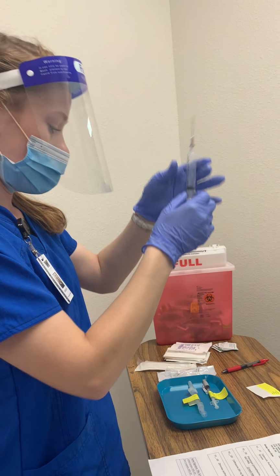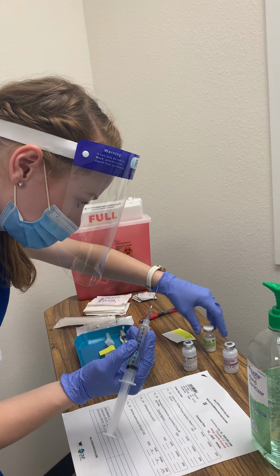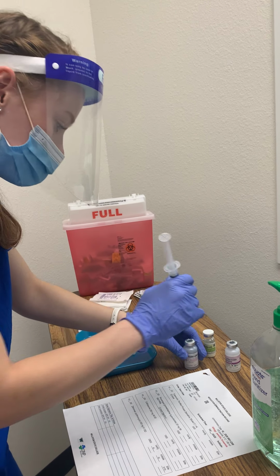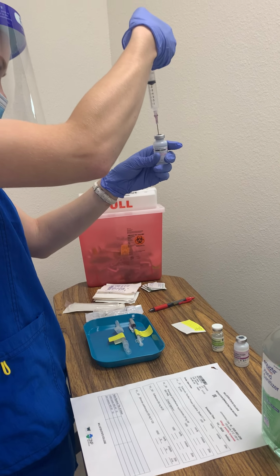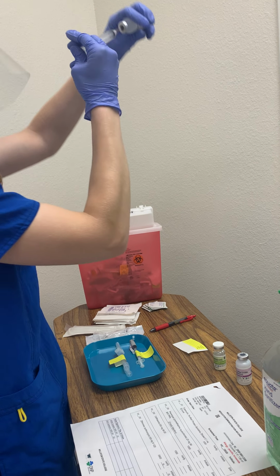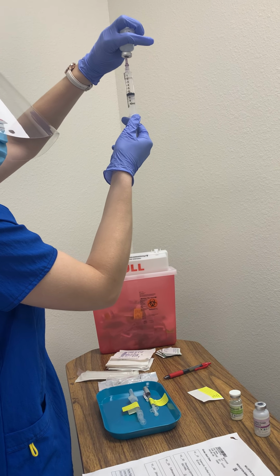There we go. And then I'm just going to be injecting this with sterile water. And so I checked 10 mils, so that's correct. The expiration date is good. So I'm going to make sure I'm above the water line, and be slowly pushing down. And then I'm going to be slowly retrieving my 10 mils.